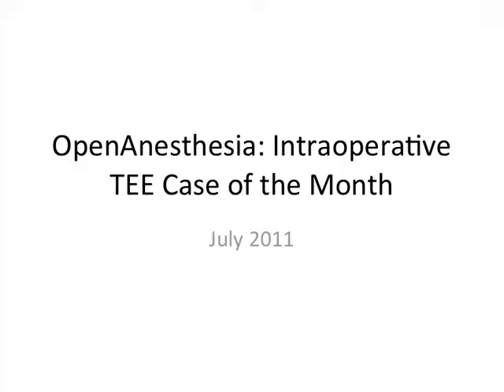This is Dr. Julie Huffmeyer with our Open Anesthesia Intraoperative TEE Case of the Month for July 2011. Each month we will feature an operative case which teaches or emphasizes an important aspect of basic intraoperative TEE.